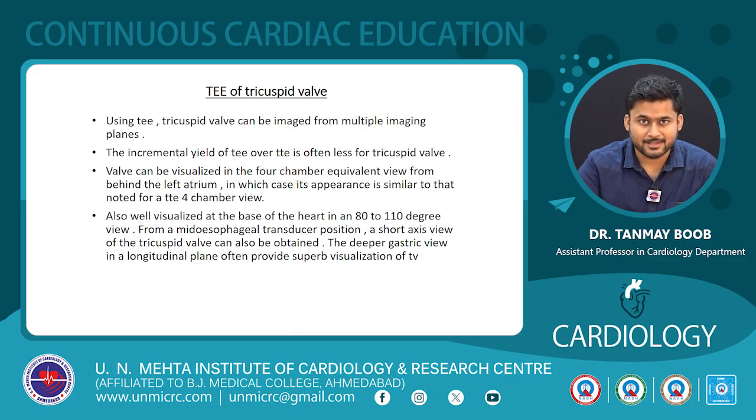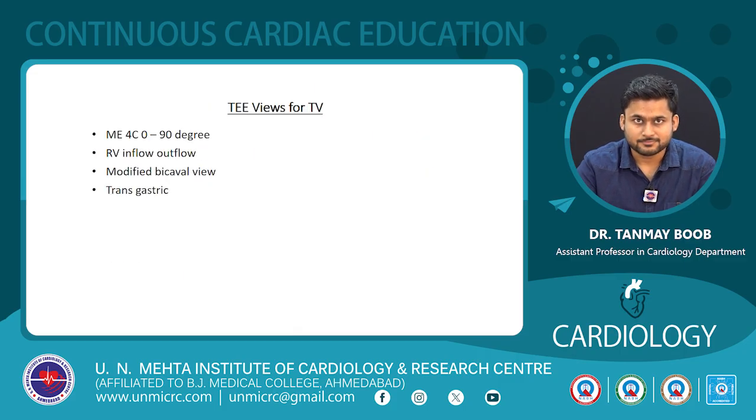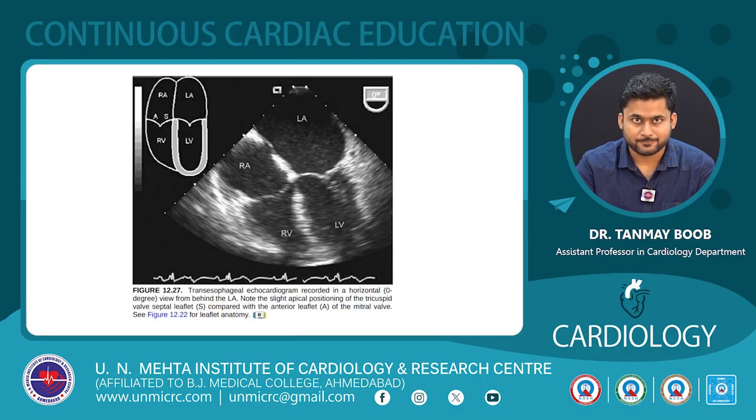The transgastric view, the deeper gastric view in a longitudinal plane, provides a good visualization of the tricuspid valve, as we will be seeing in subsequent images. The four views which we have discussed are the mid-esophageal four-chamber view from omni angle 0 to 90 degrees, the RV inflow-outflow view, the modified bicaval view, and the transgastric view.